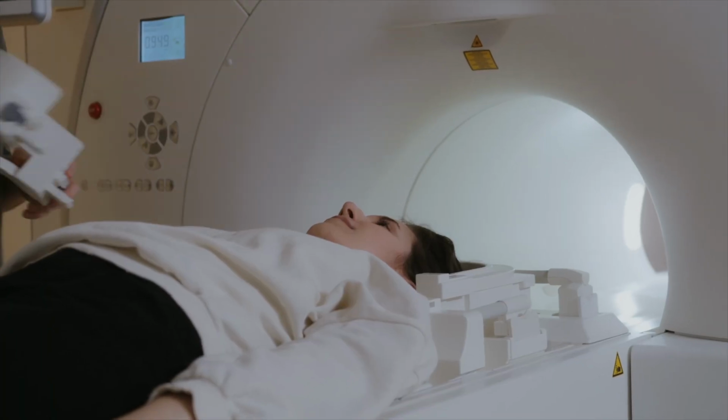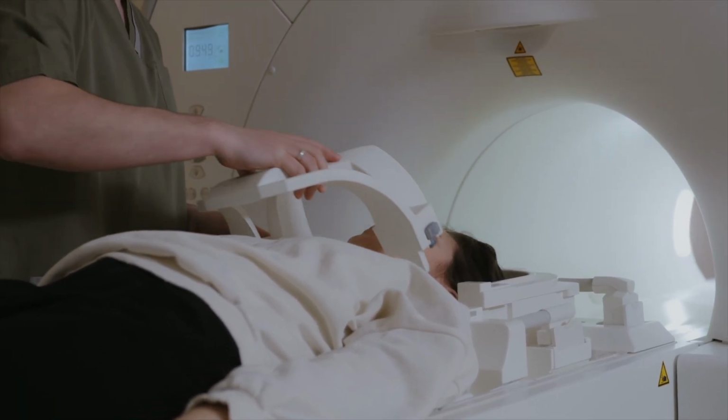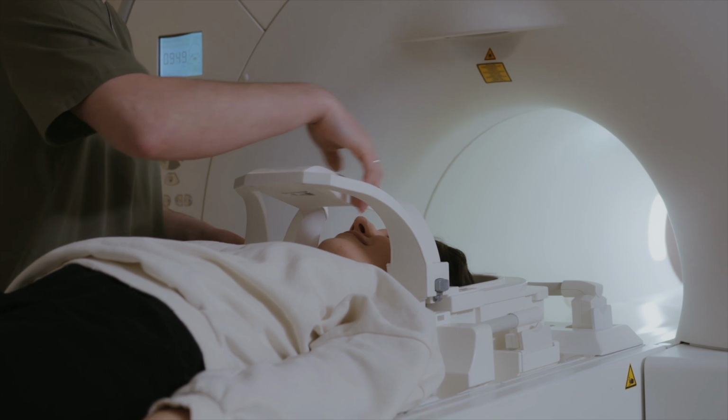Medical imaging, when it comes to cancer patients, mostly we help with CT scans. And when we talk about CT scans, we do it in two parts. One is the diagnostic, and the other is for planning purposes. When they are planning therapy for the patient, they need a CT scan.